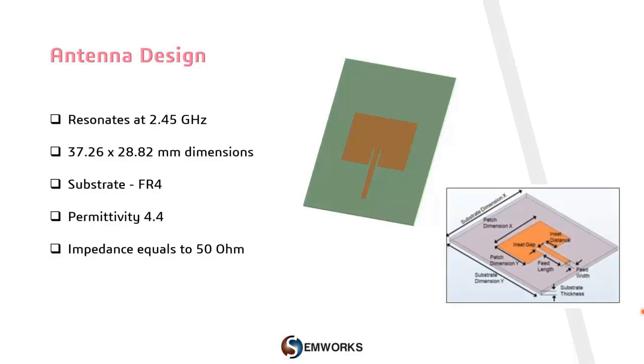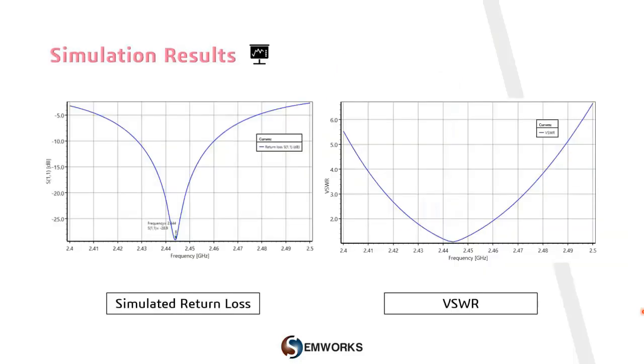The simulated results of return loss and VSWR of the antenna are illustrated in this figure. The antenna realizes a return loss below minus 10 dB between 2.4 GHz and 2.46 GHz, and it resonates at 2.44 GHz. The VSWR is less than 2 at 2.45 GHz, which indicates that the antenna has a good match.